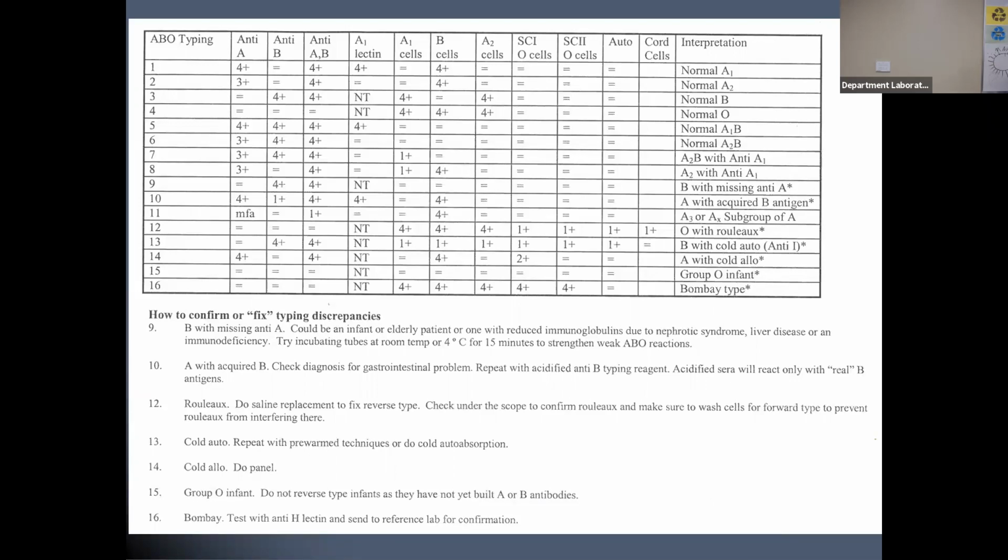So if our patient doesn't have any H, for Bombay patients, they don't have any H being produced. Remember, for what you lack, you can build the antibody to. So this patient has anti-H. It will react with your screening cells because they have the greatest amount of H. So our Bombay patient's anti-H is reacting to the H on screening cells. That's why his IAT is positive.